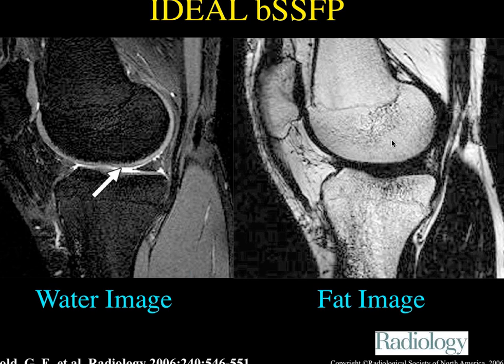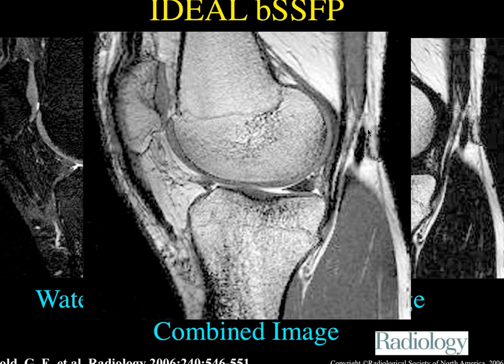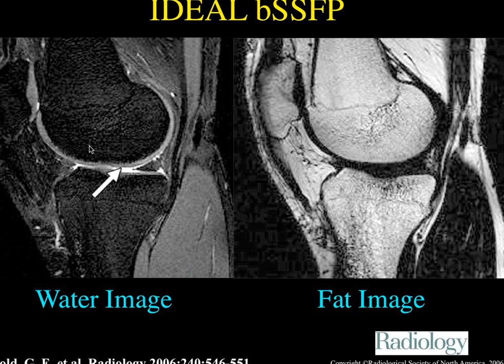Dr. Fatemi and I like to use this technique, especially in the foot and ankle. I like it in the other joints as well, though some of the other doctors tend not to like the contrast quite as much. One of the things is that the fat suppressed image looks very much like a PD fat sat image as far as contrast.